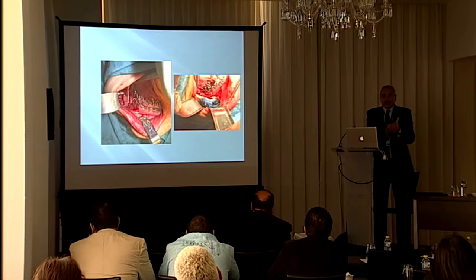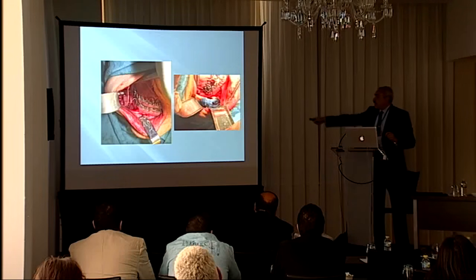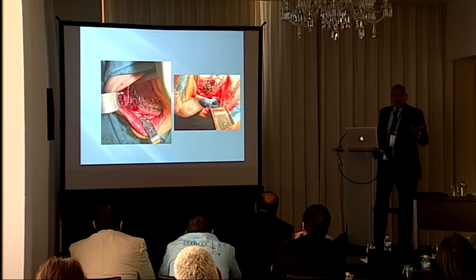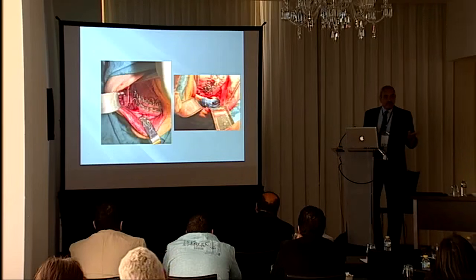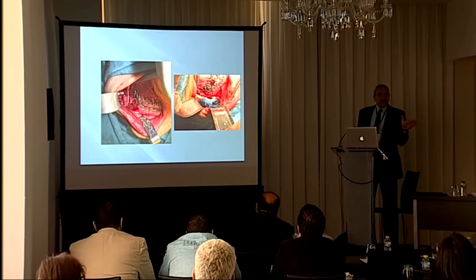And we thought that we're doing a good thing, but when we tried to adjust the condylar position exactly on the computer, I found out that in setbacks, especially in setbacks, but even in mandibular advancements, you have a space in between the segments. And when we push those segments to meet each other, actually the condyle rotates inwards. And this explains why we do orthognathic surgery for some patients who never had joint problems before and end up with a TMD, with a temporomandibular joint disease after the surgery. We were rotating the condyle inwards in case of setback and outwards in case of advancement.